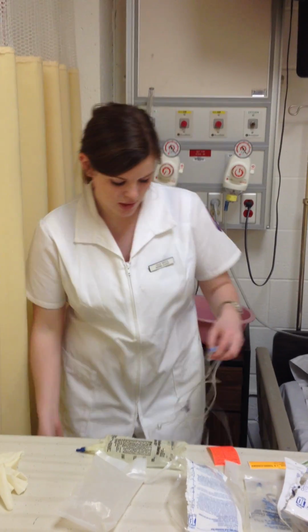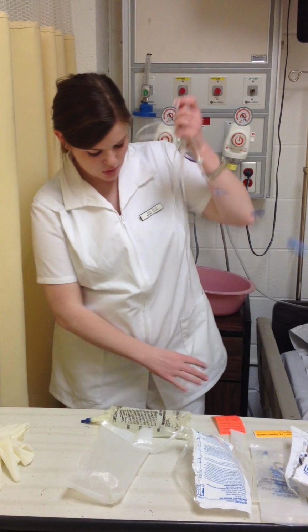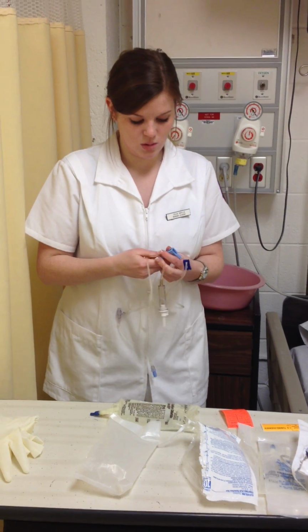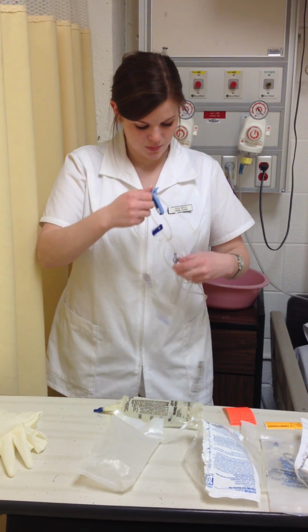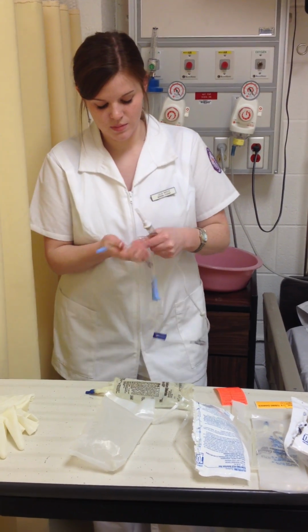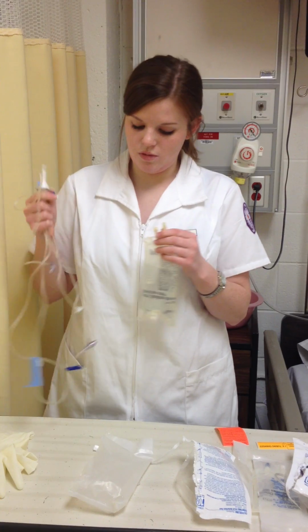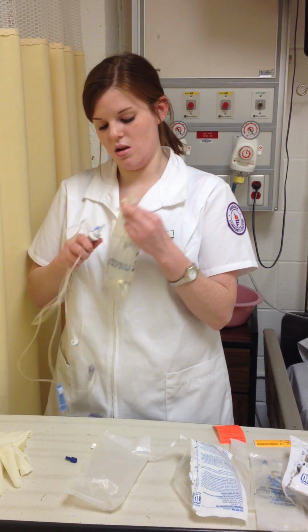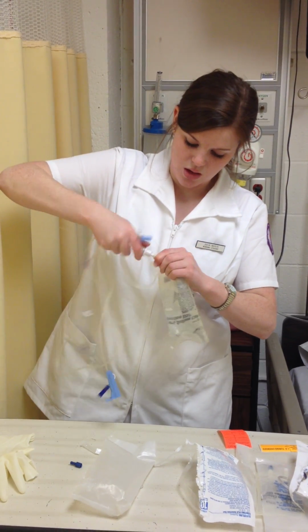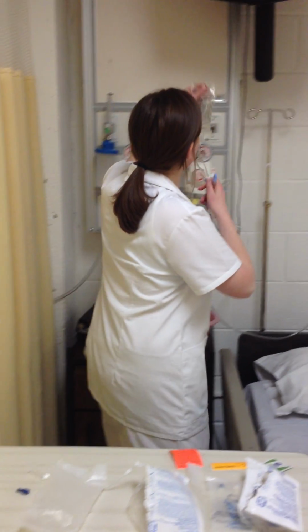And the first thing I'm going to do is untangle it. And I'm going to make sure that the clamp is closed and moved up. Then I'm going to remove the tops of the IV and remove the tops of the needle. I'm going to insert into the IV solution. Twist it on there. Then I'm going to hang it.